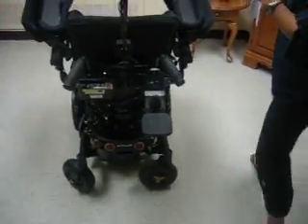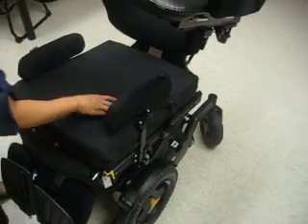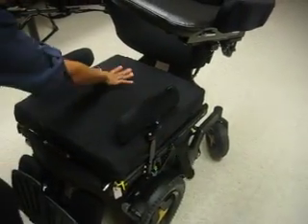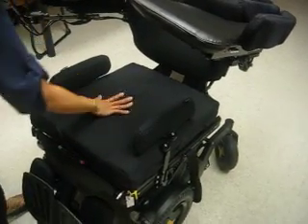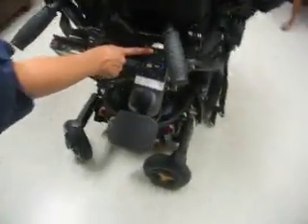Open the seatbelt and check the cushion. Check that the cushion is inflated properly. Put the chair into tilt by turning the power on with the green button.